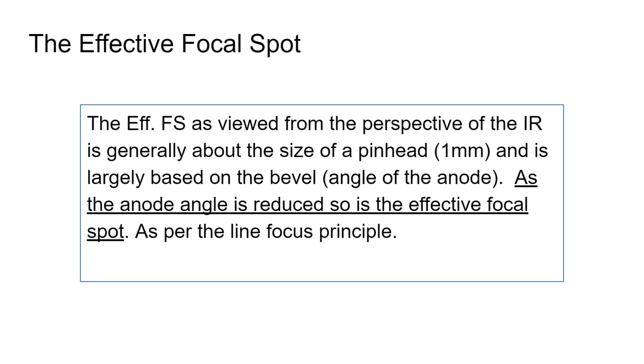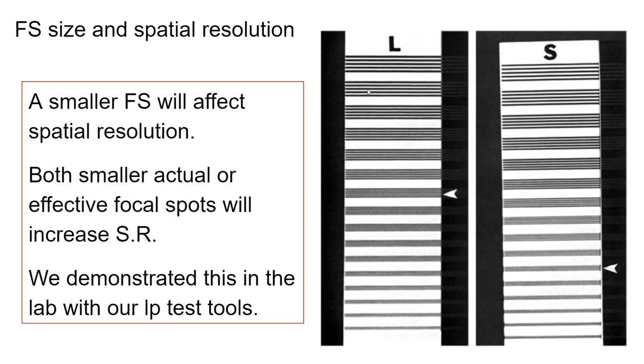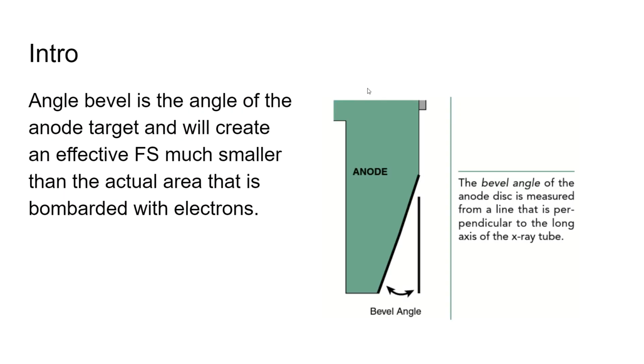Right. So if we go back here for a second, if this is our actual focal spot, so filament is down here, this is our actual focal spot, right?